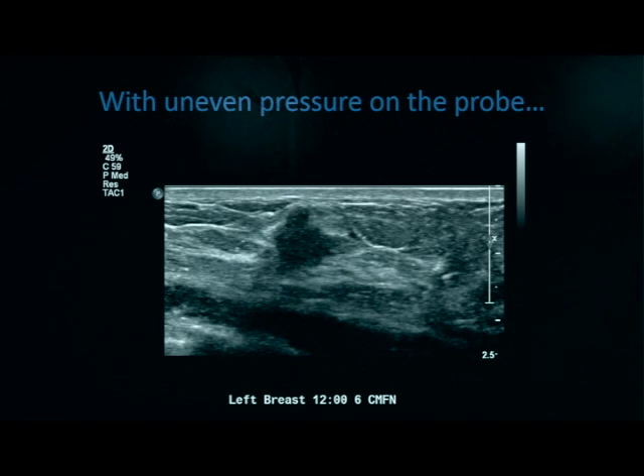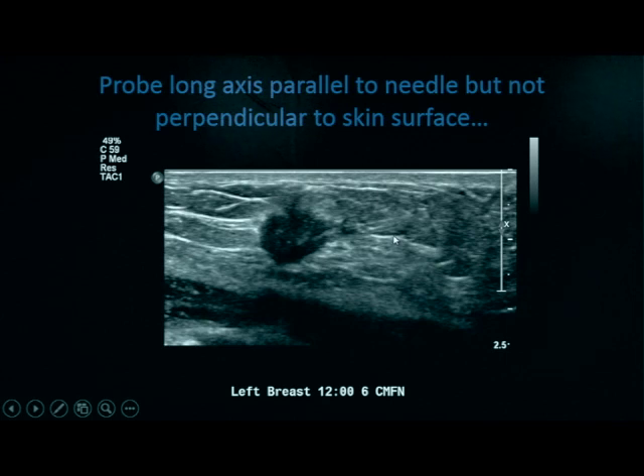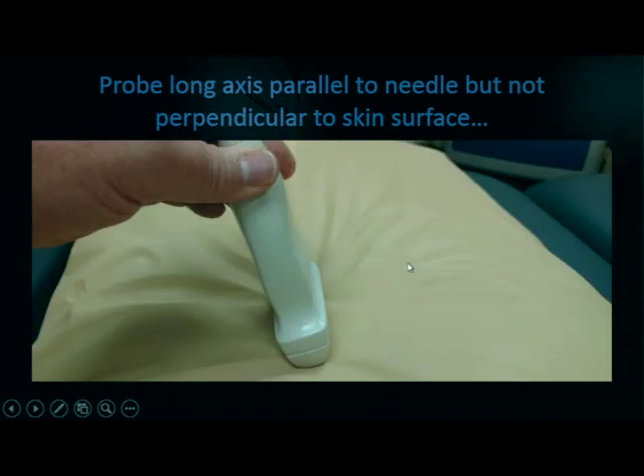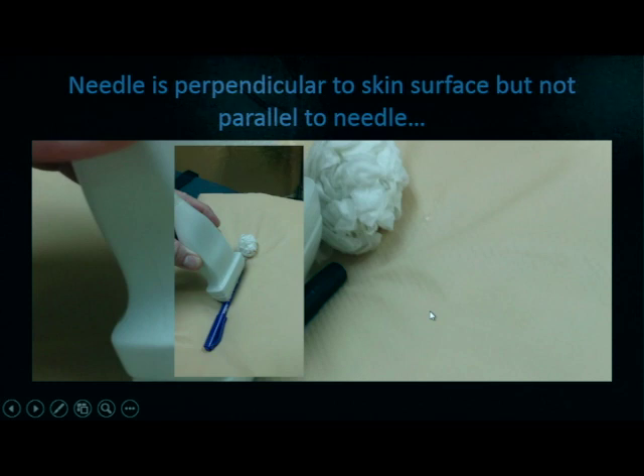Here we have a left breast lesion at 12 o'clock, 6 centimeters from the nipple — annotated as 12 o'clock position, 6 centimeters from the nipple. With uneven pressure on the probe, we can see that we only see part of our needle — this can be caused by heel or toe pressure. With the probe long axis parallel to the needle but not perpendicular to the skin surface, you can produce a similar picture. If the probe is not perpendicular to the needle or the skin, what we're catching is an off-axis glimpse of part of the needle but not the entire thing, which can be incredibly dangerous for sampling the wrong area and causing complications.